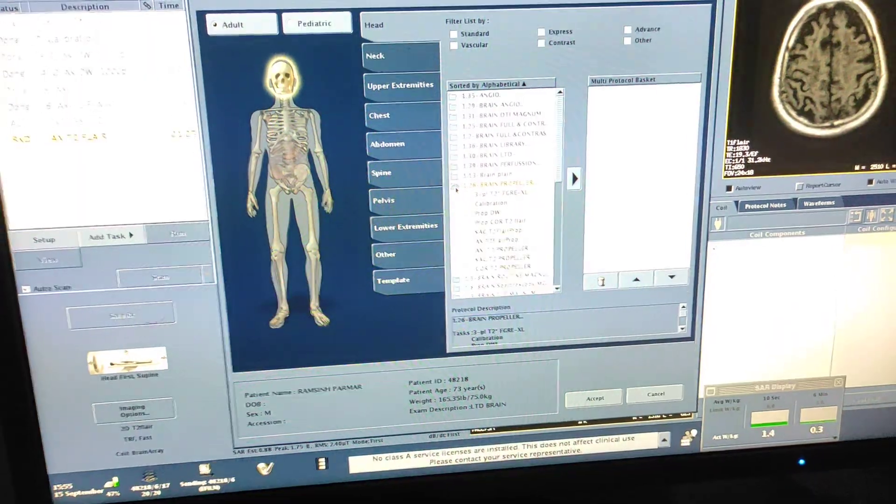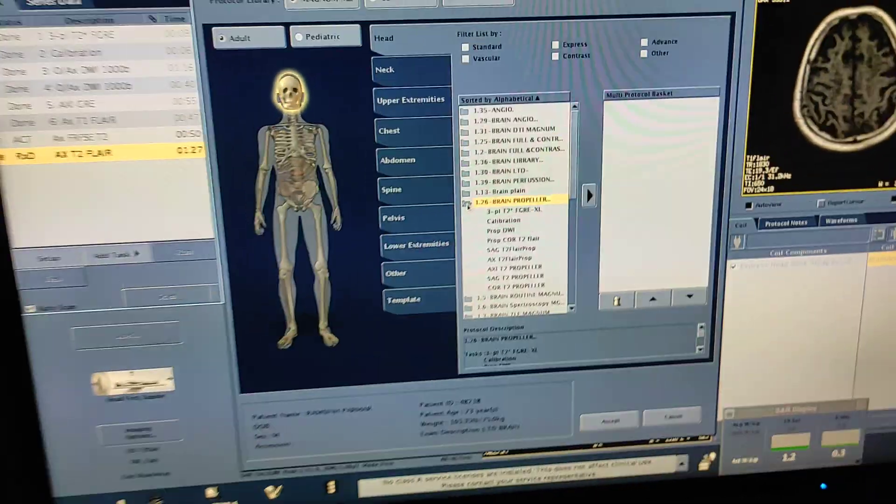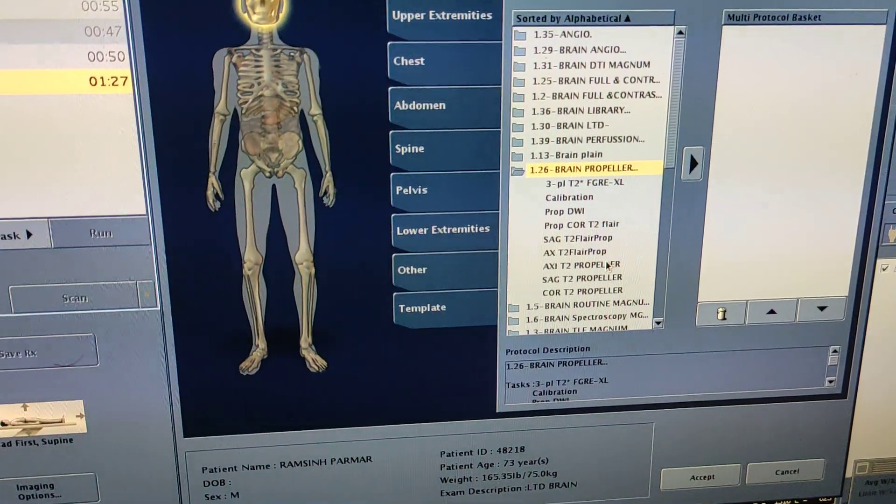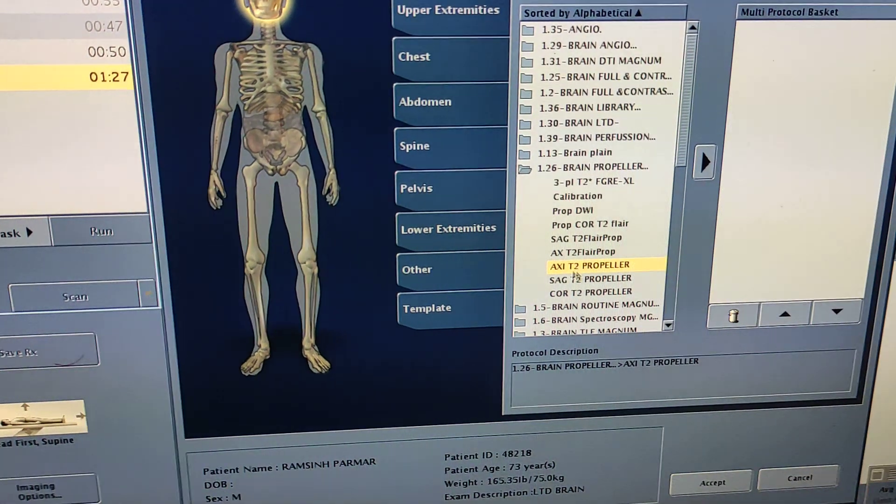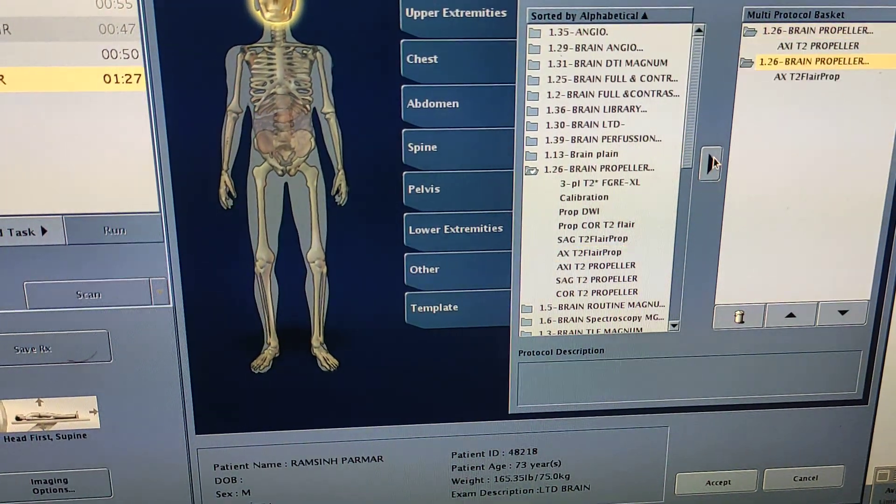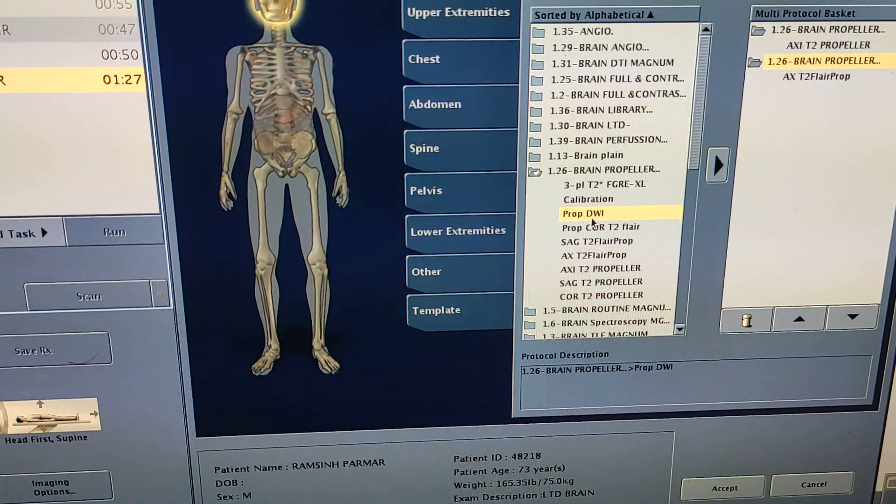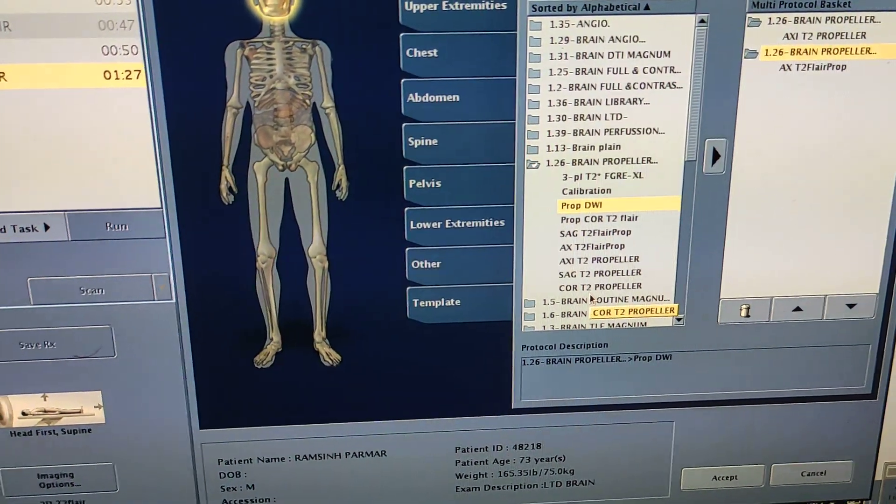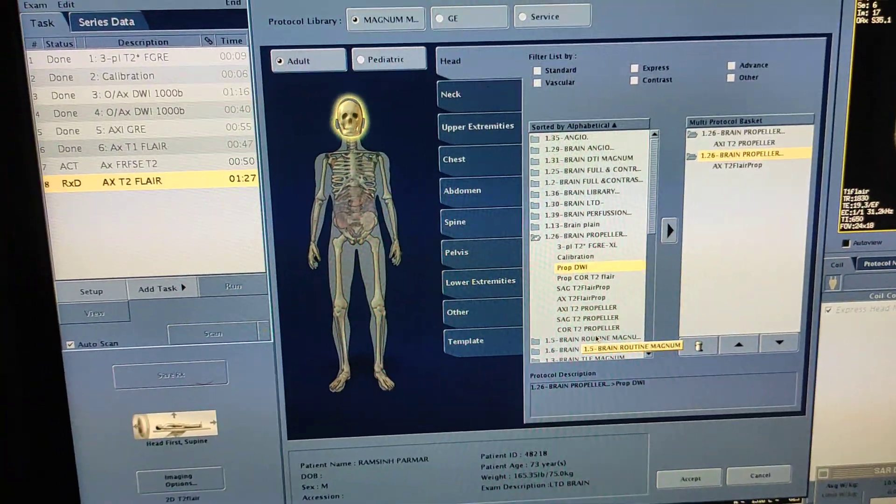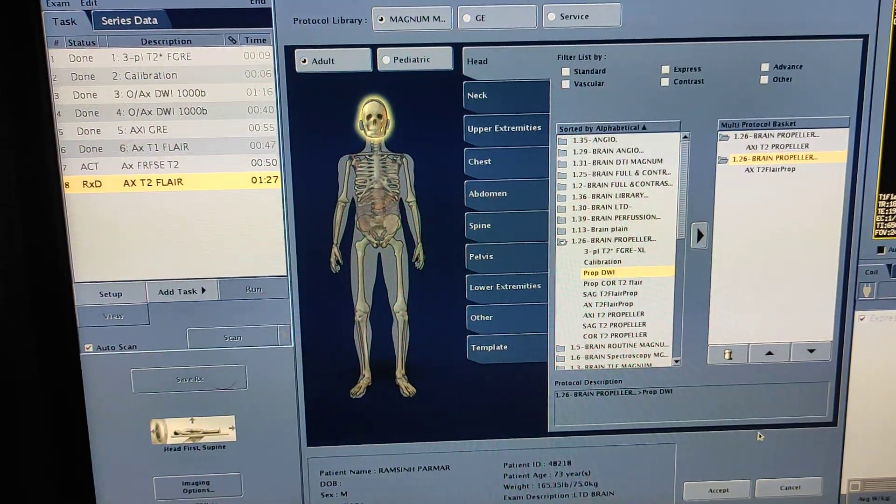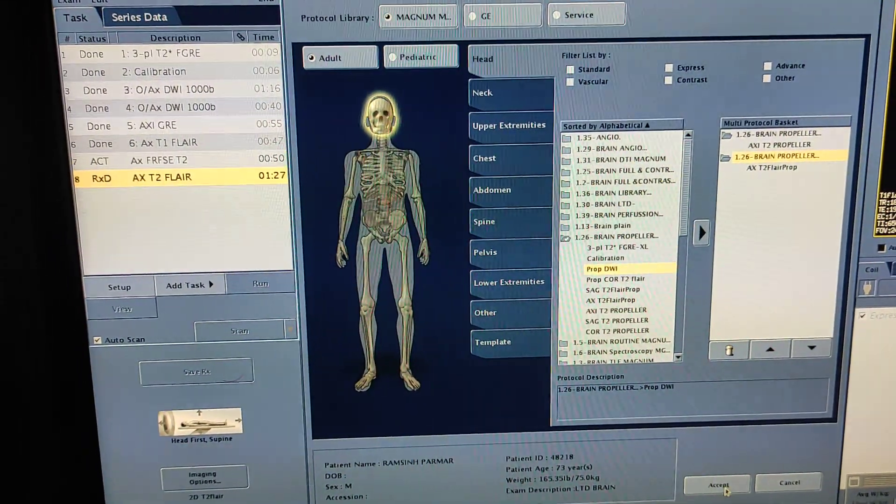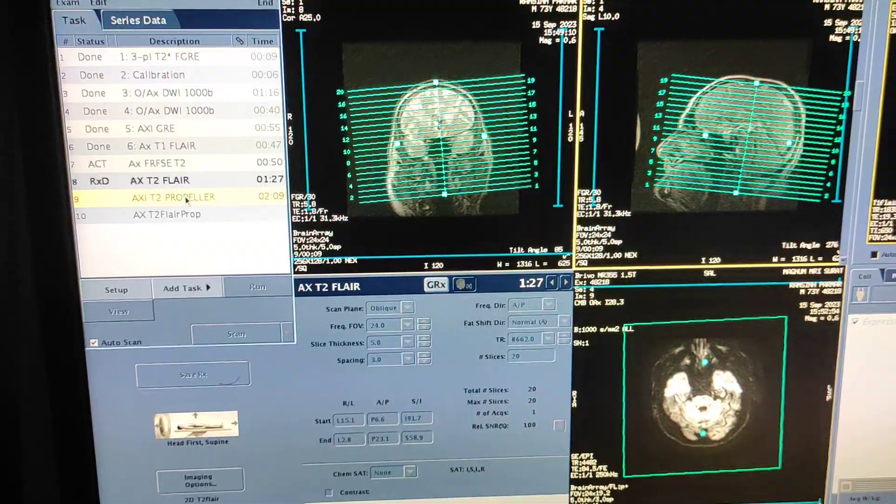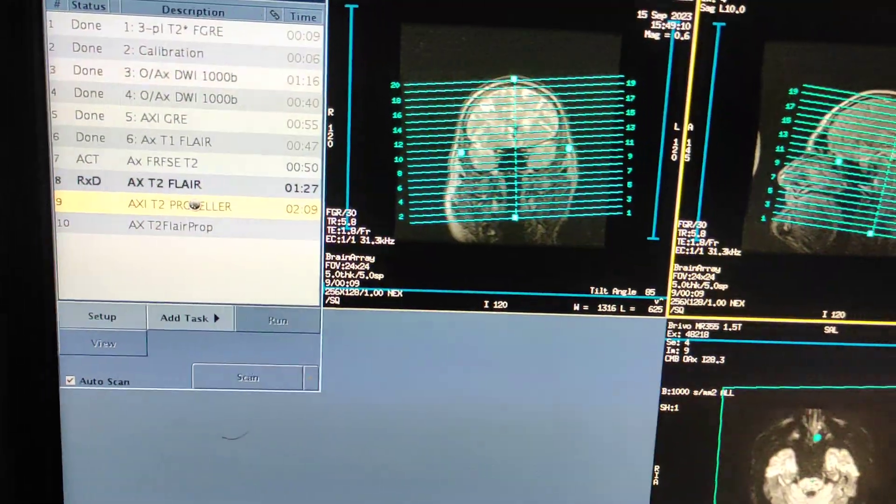Here is my propeller protocol. You can see the sequences: axial T2 propeller, axial FLAIR propeller, DWI propeller, sagittal to coronal T2. Axial T1 and axial GRE - propeller is not there, so I cannot take propeller for those sequences.